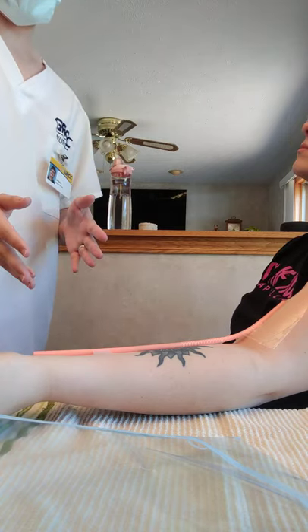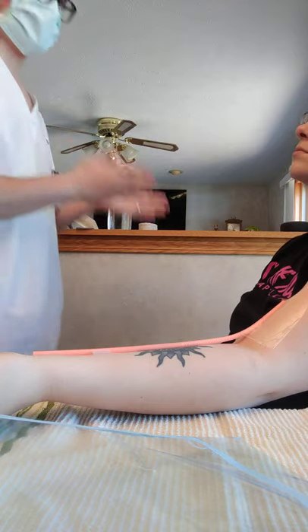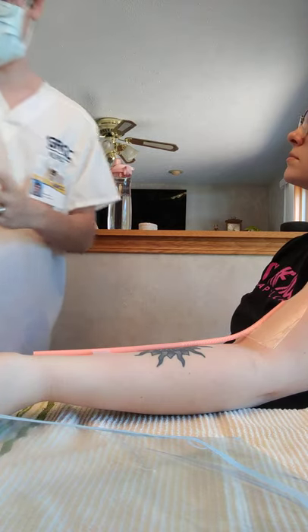All right, next I'm going to simulate flushing the catheter and then putting in a new locking solution. So I'm going to wash my hands and don some gloves.